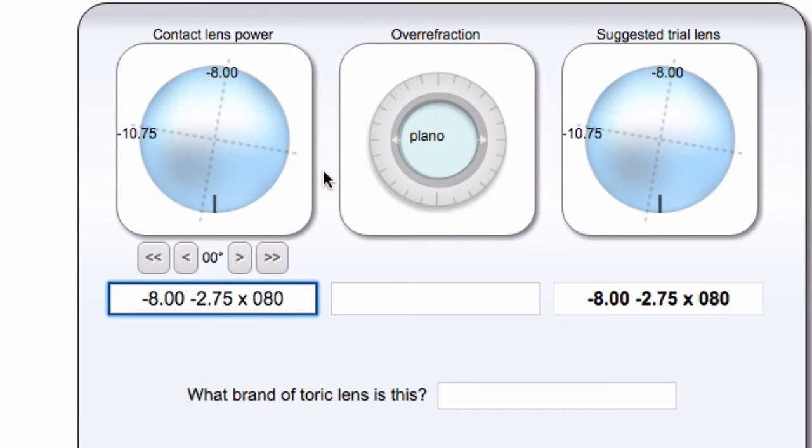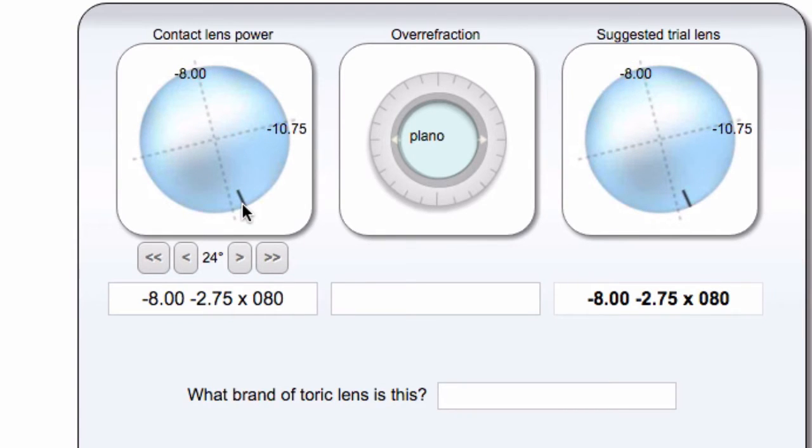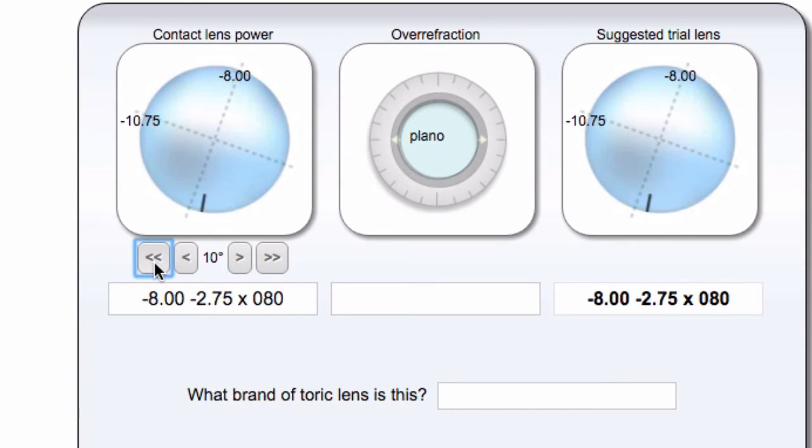You can kind of visualize how the powers line up on the lens, and then to denote the rotation, you can just click on the lens. That's one way to do it, and it will move to where your rotation is, and sometimes that's a little bit easier than saying it's 10 degrees or 20 degrees, because sometimes we're not the best judges of that. You can also click these arrows to adjust it by one degree increments, or these double arrows will adjust it by 10 degree increments, and you can just put the lens where it was sitting on the patient's eye.